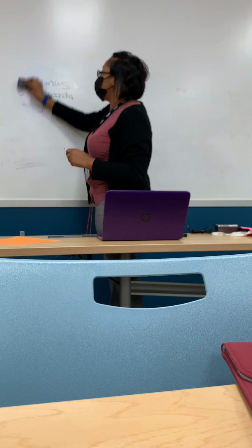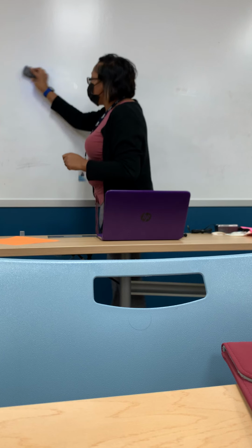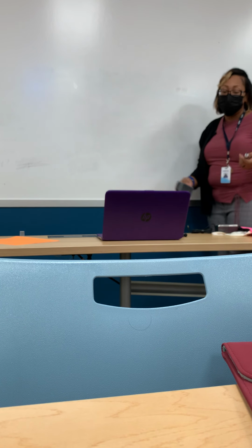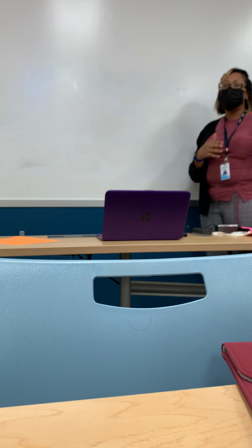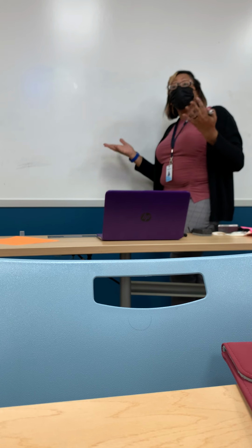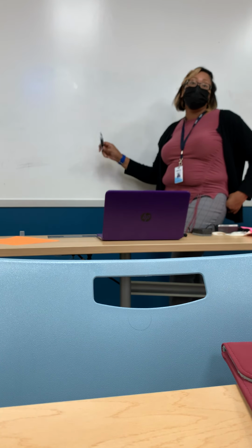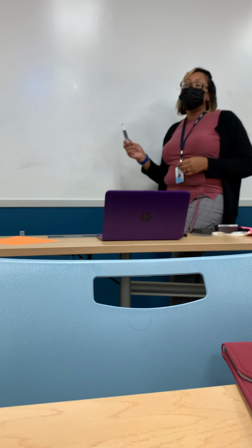That's all you need to know with rhythms. You get an EKG class when you learn to measure and all that in Capstone. I don't want you to know the measuring. I just need you to be able to look real quick and say, oh, that doesn't look right. And those are the 7 that if you ever work on a telemetry unit, you have to take a test. If you miss the VTAC and VFib or the AFib and A-flutter, they will not let you work it. You automatically fail. You can get every other rhythm on that test correct, but if you miss those 4, you fail, because those are your lethal rhythms. Those are the deadliest, so you have to know them.